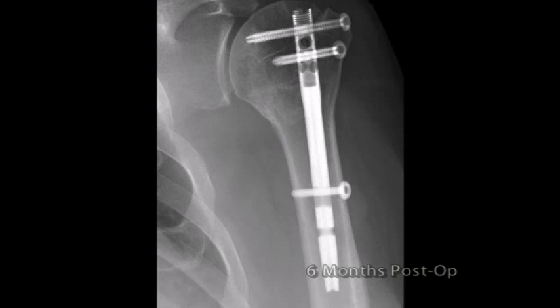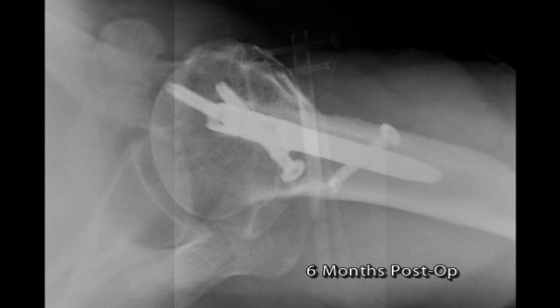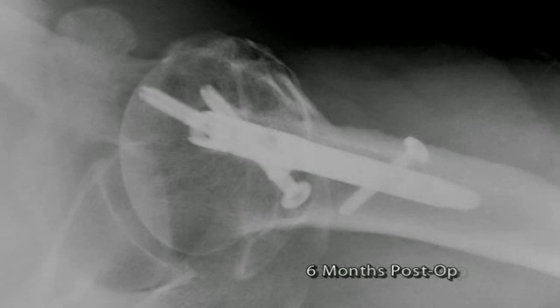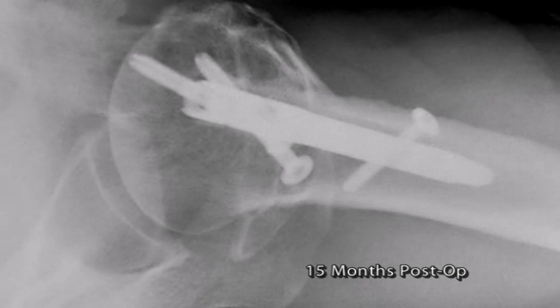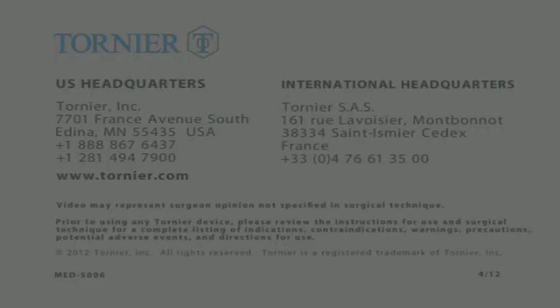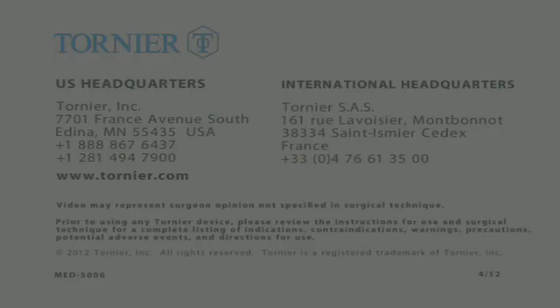The Tornier Aqualis Proximal Humeral Nail is specifically designed for minimally invasive reduction and stable fixation of displaced proximal humerus fractures. Its anatomic alignment, proximal locked anatomic tuberosity screws, and distal dynamic fixation provide a unique combination of limited exposure, anatomic compressive fixation of the tuberosities, and dynamic impaction of the surgical neck fracture. Please feel free to visit the website www.tornier.com to learn more.